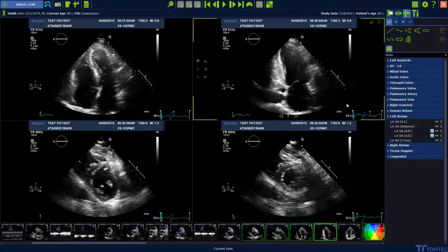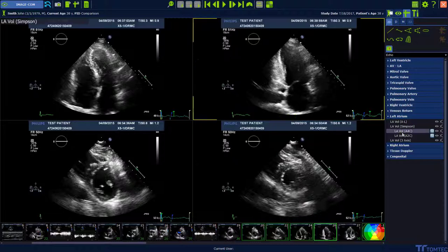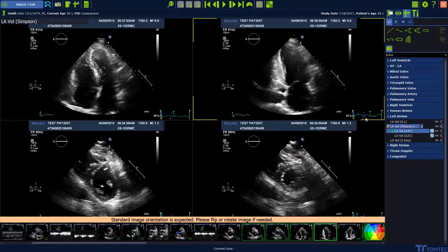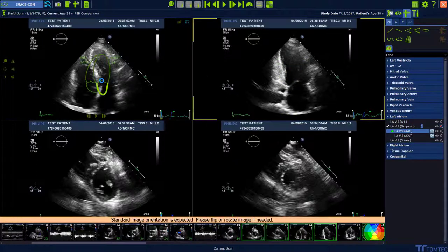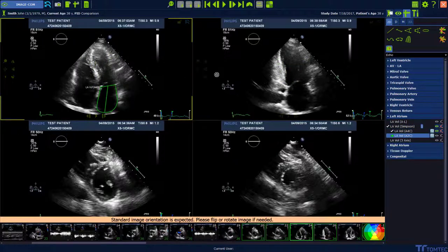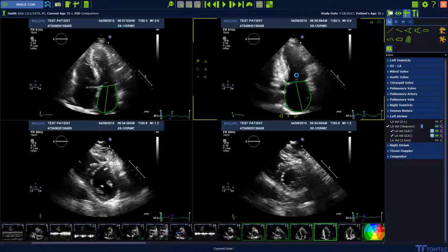The software expects the standard image orientation, so if needed, please use the flip or rotate button in the smart regions to correct your image orientation. Now start the analysis with the automatic detection button and tell the software where to find the 4-chamber view and the 2-chamber view.